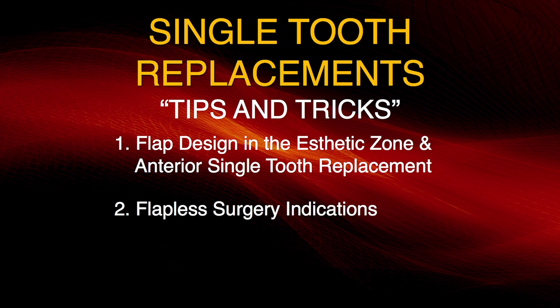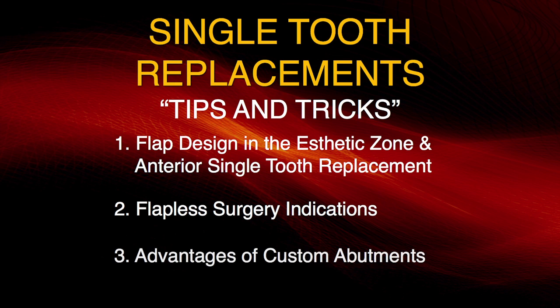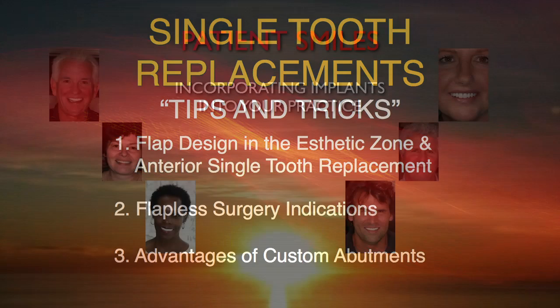The second portion of this presentation is going to deal with flapless surgery indications, illustrating some cases. And the third portion is going to be dealing with the advantages of custom abutments. So first we're going to start with flap design incisions in the anterior and the aesthetic zone.